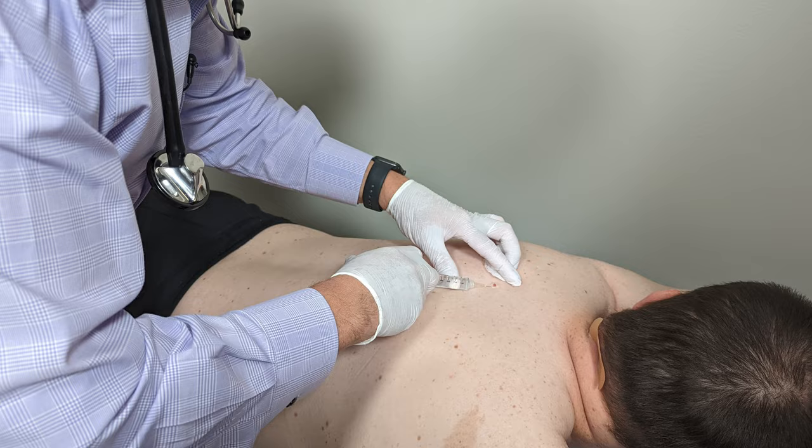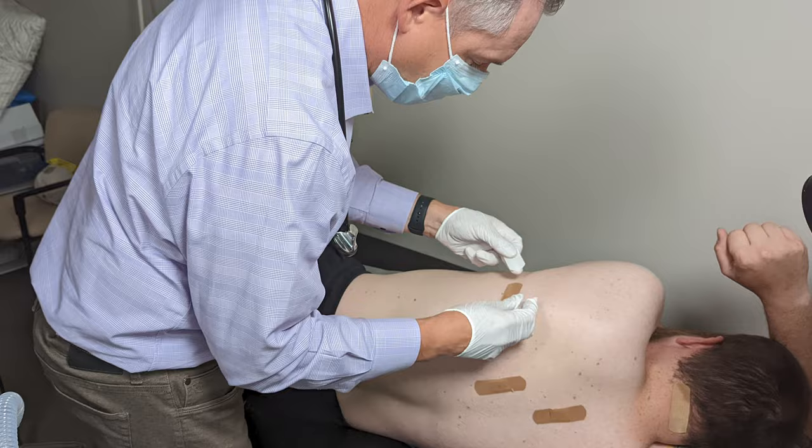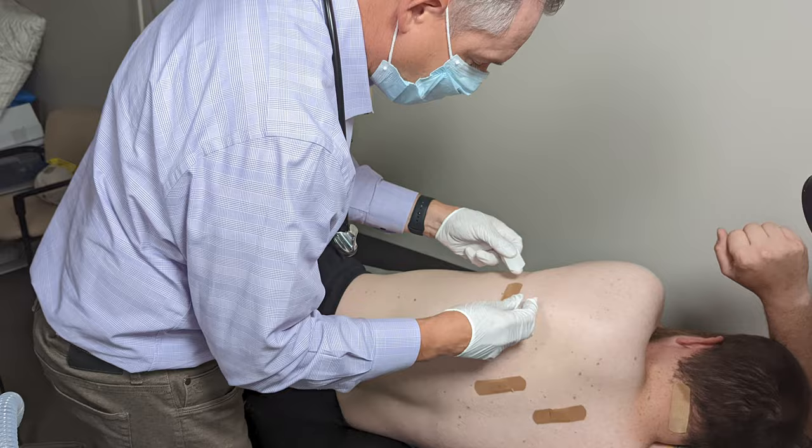I'm gonna send these off to pathology and then we'll get the report — it usually takes about seven to ten days and I'll let you know if there's any issues. The biggest complication is if something comes back abnormal; we'd have to do a full excisional biopsy with margins. I don't think that's going to happen, but that's what we'd do.